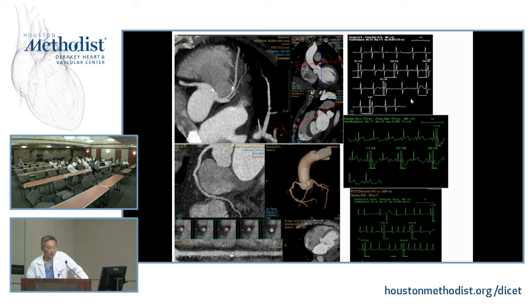And this is, again, I'm going to show, the study is pretty good. It's a diagnostic test. So when we used to have the Philips 64 scanner, we would never do coronary artery CTA with this rhythm. The first one and the third one, okay? Number 1 is very fast, very irregular. Now, it's almost not an issue anymore. We might not be able to see 100% of segments, but we can see the majority of segments, especially the proximal segment.